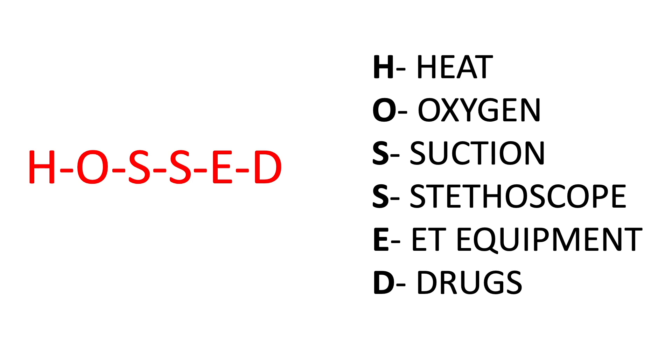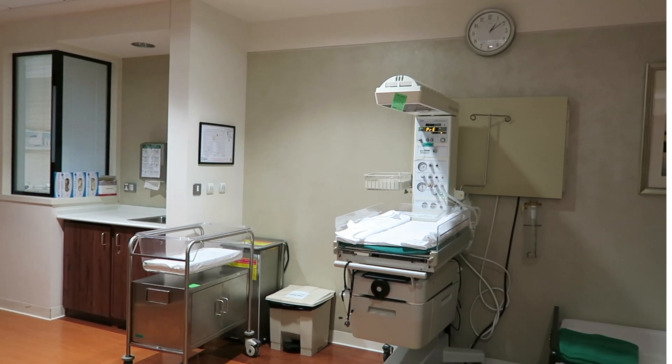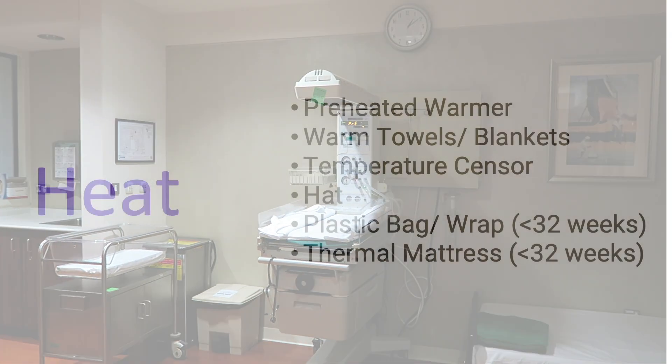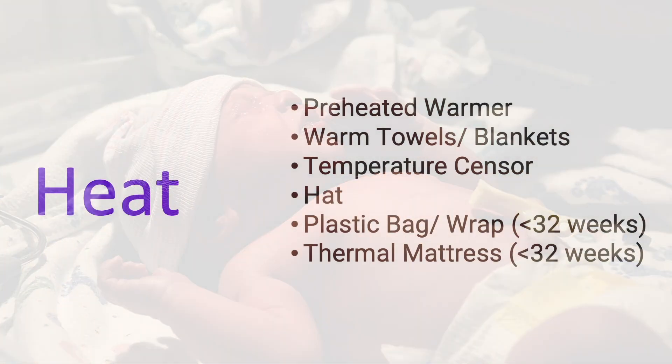I follow the same approach as what you would follow when managing a patient using the NRP guidelines. Under heat, you need to have a preheated warmer — make sure the device is plugged in. We need warm towels and blankets, make sure the temperature sensor is available, and a hat to keep the baby's head nice and snug.